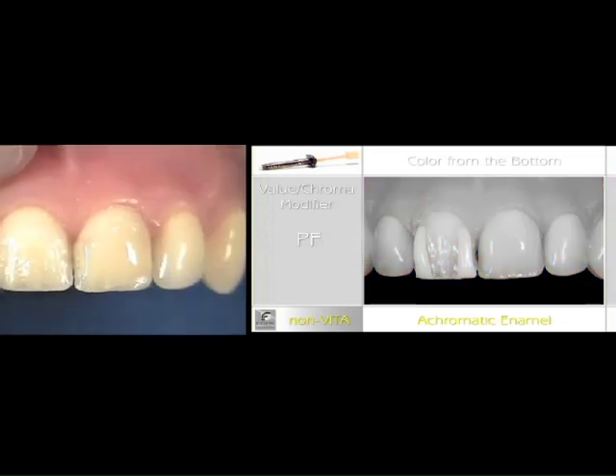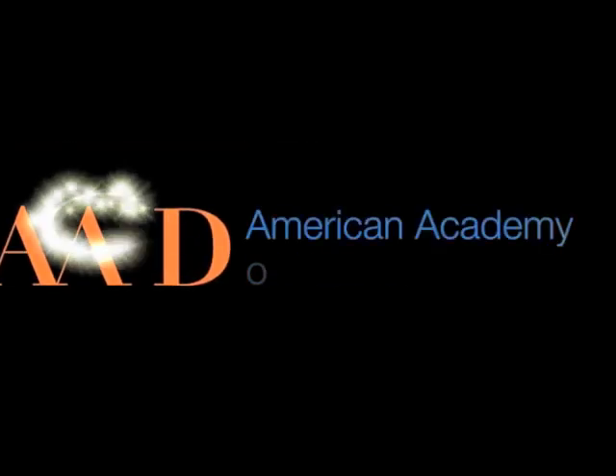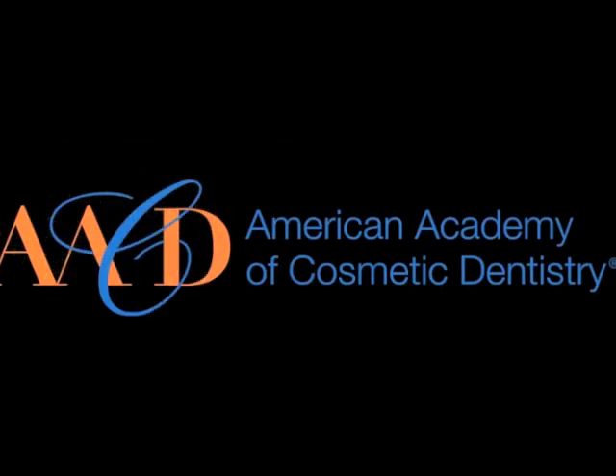I will apply it, and you can tell the difference in value at a thicker layer. Here's a little trick: if you want to make truly beautiful looking lobes, make the lobes higher in value than the center lobe. The rule of thumb would be pearl frost proximally and transfrost at the center. It looks really gorgeous.